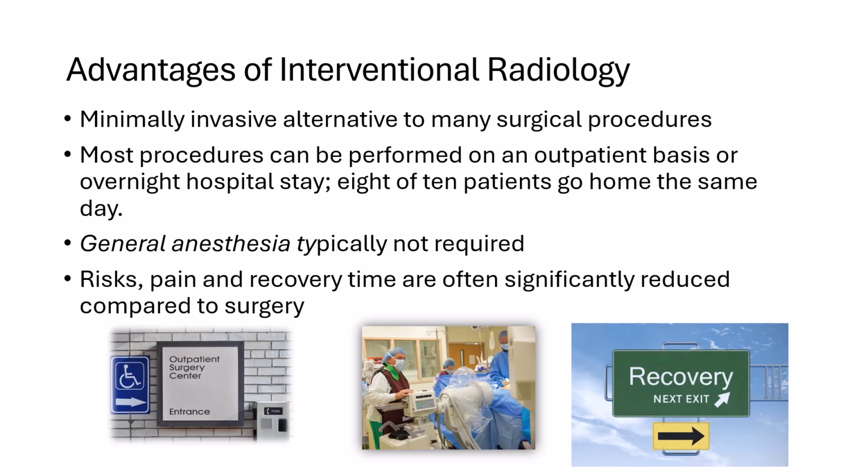Interventional radiology, also sometimes called keyhole radiology, has some advantages over surgical procedures. First of all, the procedure is minimally invasive when compared to surgical procedures, and most procedures can be performed on an outpatient basis or an overnight hospital stay, where 8 out of 10 patients go home the same day. Typically, we don't need general anesthesia to do an interventional procedure. The risks, pain, and recovery time are often significantly reduced when compared to surgery. These are the advantages of interventional radiology.